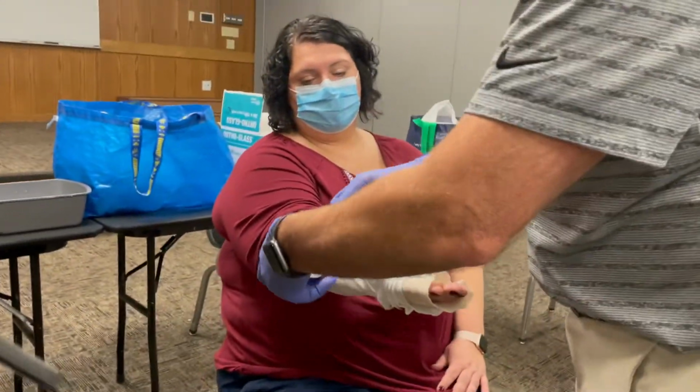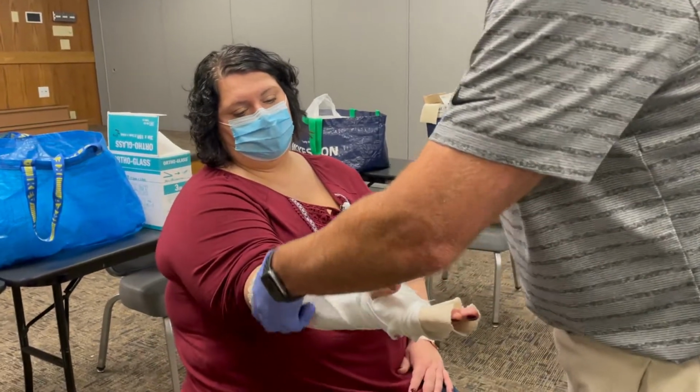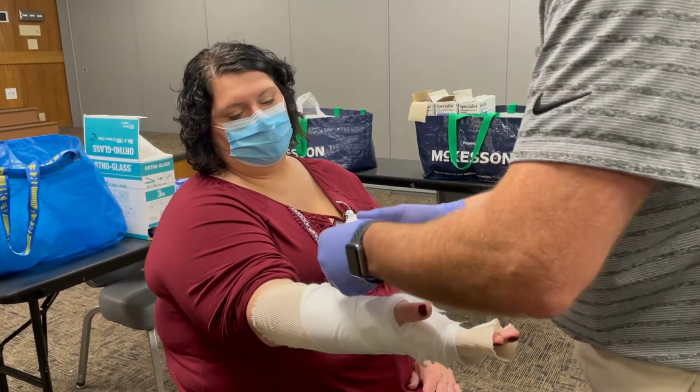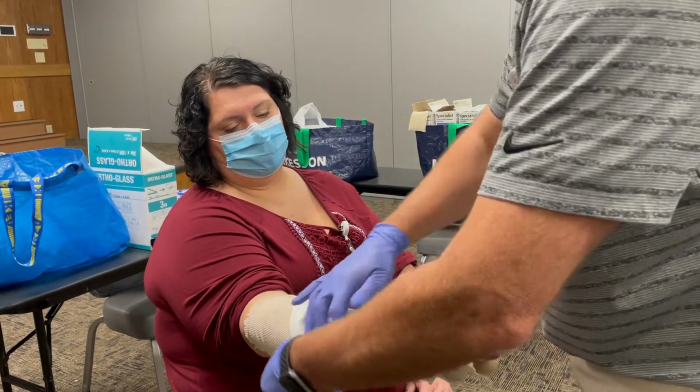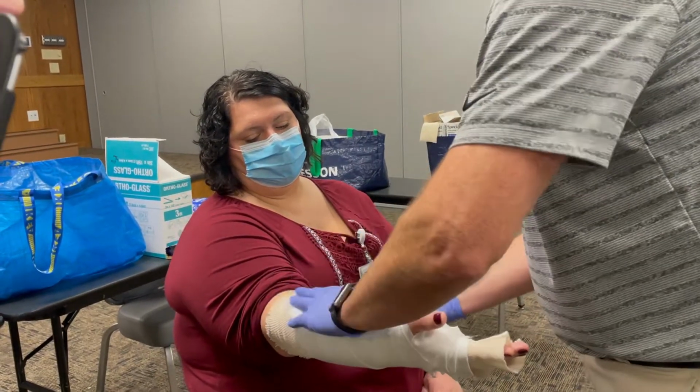Yeah, and this Webril is actually thicker. This stuff's really nice. You get different qualities of it too. But see how it's going up at an angle? I'll just tear that. It's kind of like taping an ankle. If you don't like the angle you're going, you tear it.